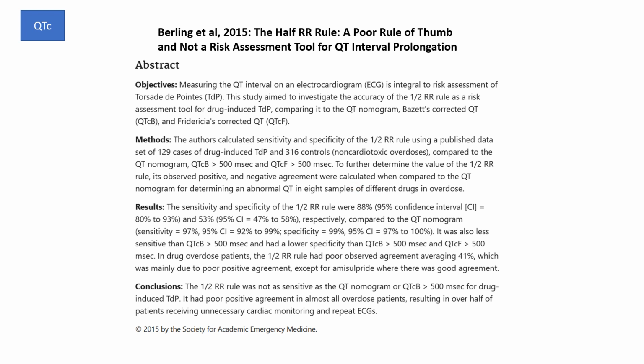And in toxicology, yes, then you probably should use a nomogram or something like that, or some of the calculators. But there are problems with the calculators as well. So as for a gold standard for this, please comment if you know. But I'm not quite sure that there's one size fits all for the QTC measurement. It really depends, and that's why I guess it's so elusive and problematic for people.